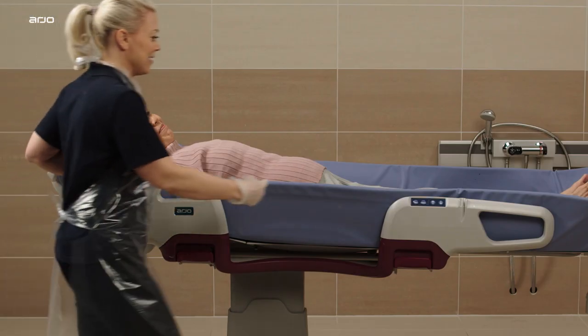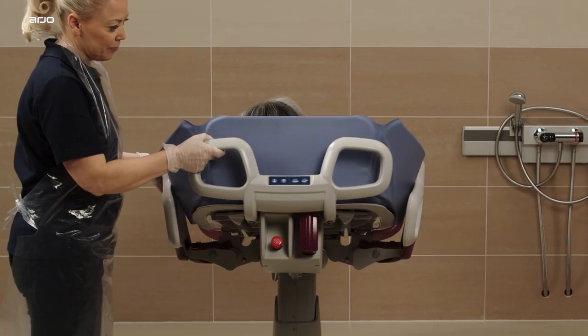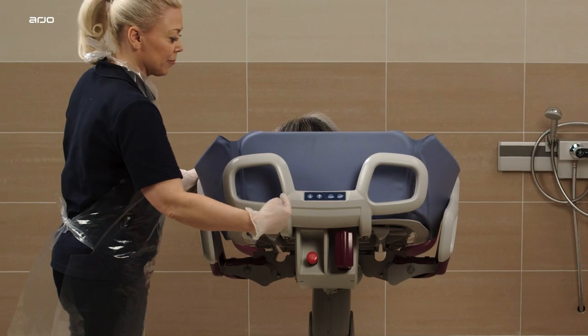The control panels are located on each side support, as well as on the head panel, allowing easy access for the caregiver.